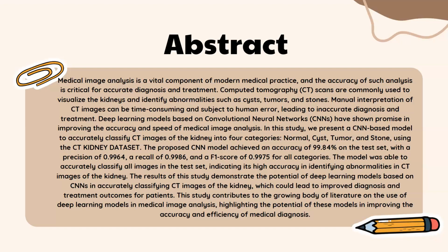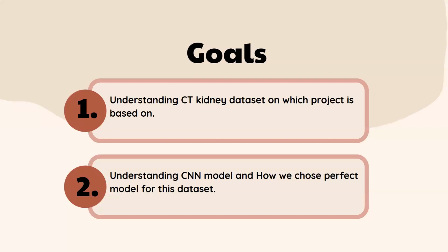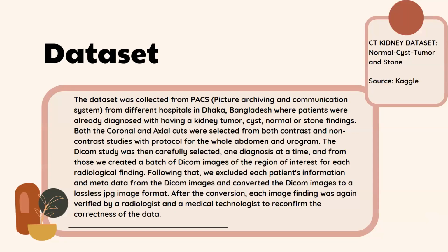As I said, the first goal is understanding the CT kidney data set on which the process is based. The data set was made in Dhaka, Bangladesh, where patients were already diagnosed as having a kidney tumor, cyst, normal, or stone findings. Both the coronal and axial cuts were selected, and both contrast and non-contrast for the abdomen and urogram.